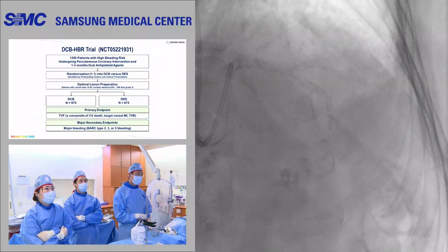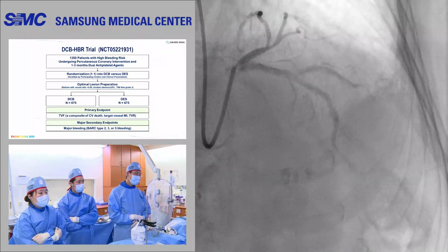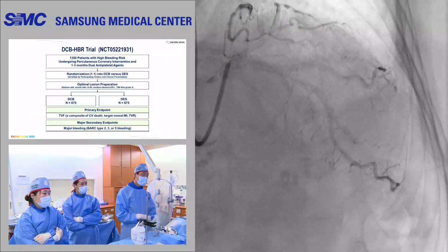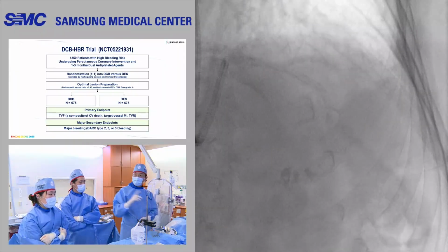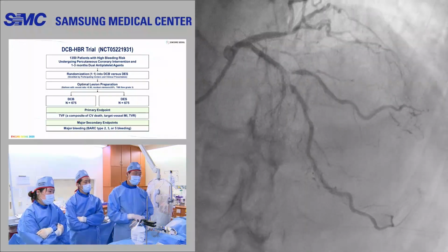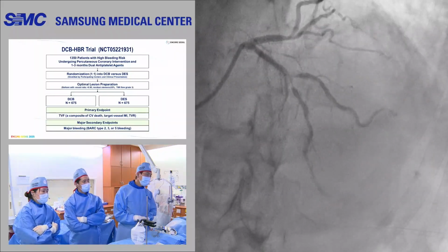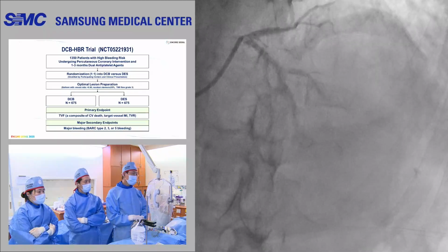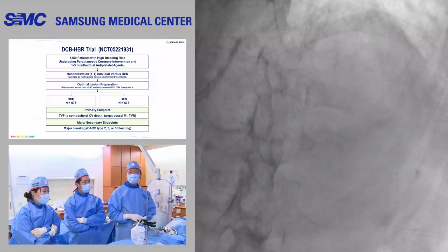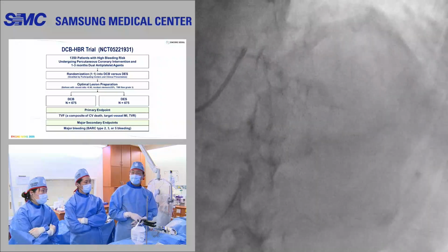Okay, today's angiography. You can see a lot of calcification from ostial LAD down to mid LAD. And the diagonal is also calcified. Next slide. And this is the angiogram, we got just two views, spanning 12 millimeters of the contrast dye. And this is a very tight lesion. The problem is that the LAD is covered with calcification. Even with a stent, I think that there is a high risk of edge dissection.